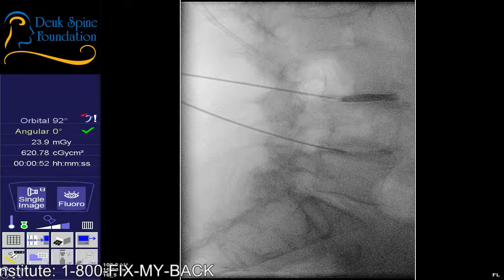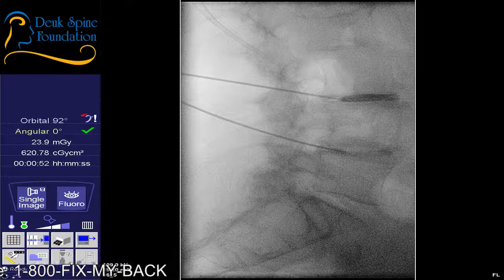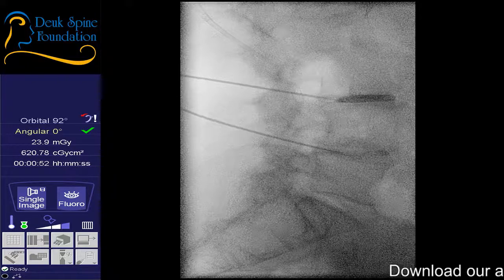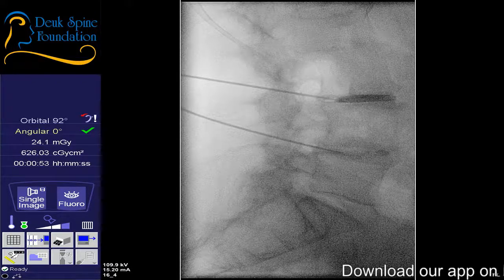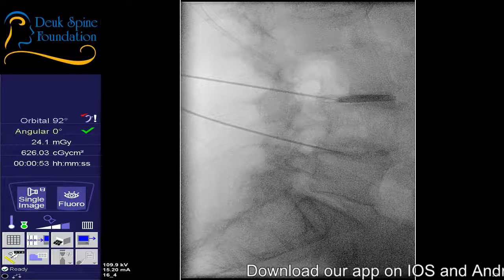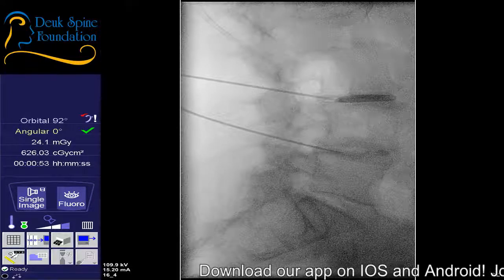So I'm going to back the needle out, and I'm going to look for my guide wire tip as I do that to make sure it's in the disc and it stays there while I back the needle out. Sometimes the needle will grab the guide wire. There it is. You can see the needle still going in the foramen, and now the tip of the needle is right at the back of the disc, but the guide wire is inside the disc.